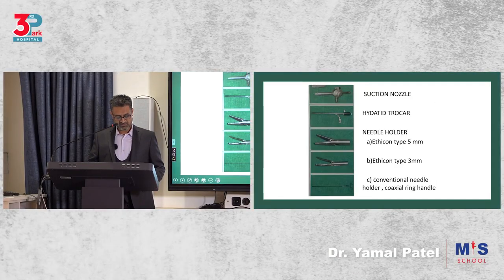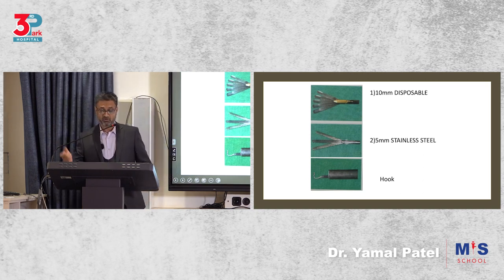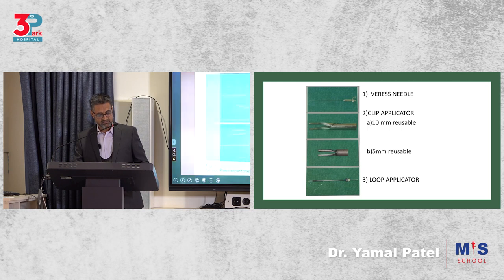We move on further. These are suction and etc. So these are just examples. We have retractors, fine retractors for the liver sometimes that we would use, a hook monopolar or a spatula, and then we have the Veress and the clip applicators.